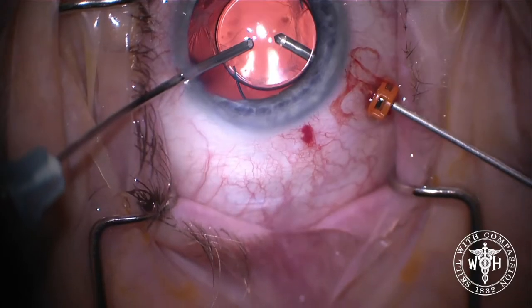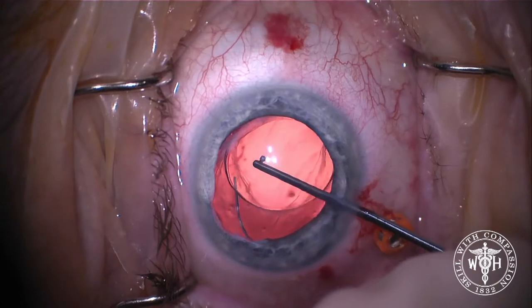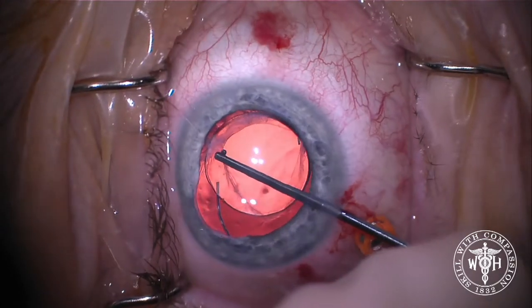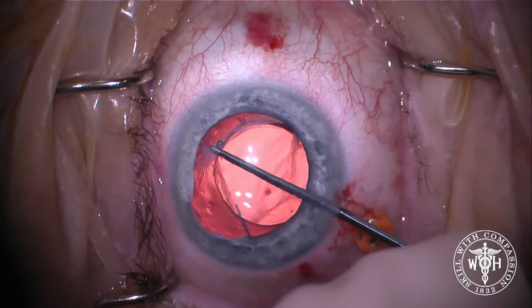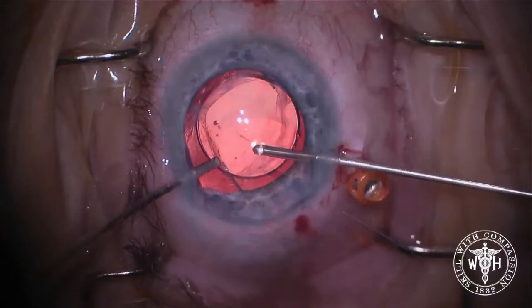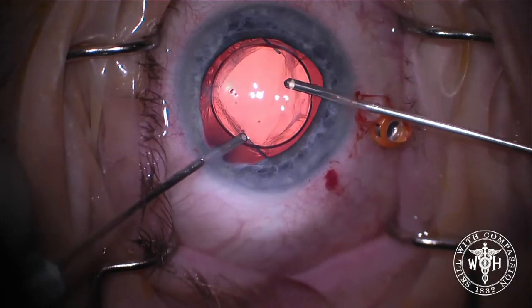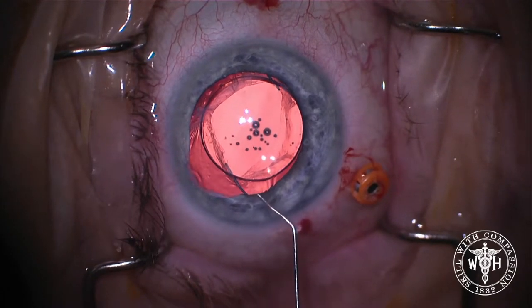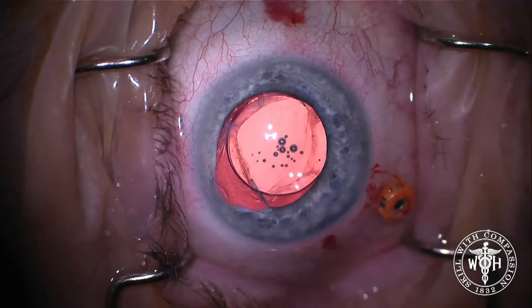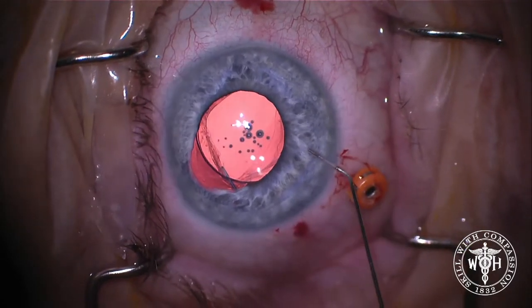She had a little chomp taken out of the pupil margin during her surgery. So I'm just doing a PARS anterior vitrectomy and really using the vitrector to vitrect more of the posterior capsule. What we've just done here is take the optic of the IOL and capture it in a combination of the anterior and posterior capsule. That's going to keep the IOL in good position and keep it far away from the iris to stop the iris chafe, stop the recurring uveitis, as well as hyphemas that she's been experiencing.